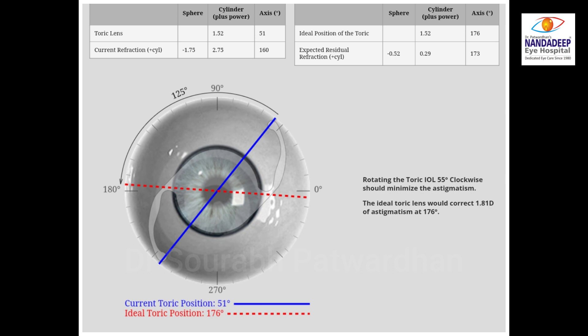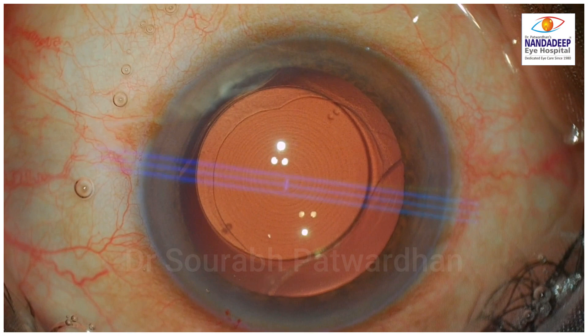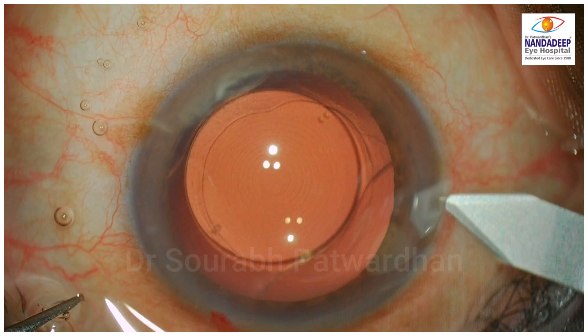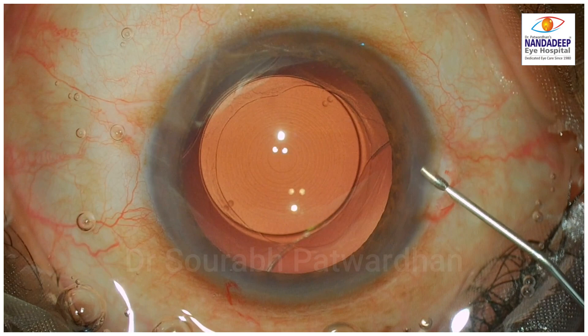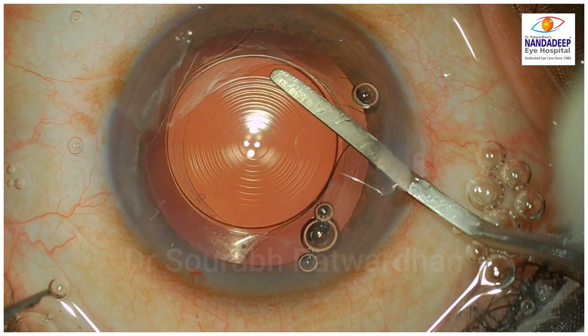Now I have to fix this. This is a hydrophilic trifocal IOL with a plate haptic design, and it is 4 weeks after surgery, so I can open the previous incision quite easily. After opening the incision, I put intracameral xylocaine and then use cohesive viscoelastic devices — there is no need for dispersive agents here. I am using 1% hyaluronate, though 1.4% can also be used, and the first step is to separate the IOL from the capsule. Being a hydrophilic IOL, it is much easier as it doesn't really stick to the capsule.